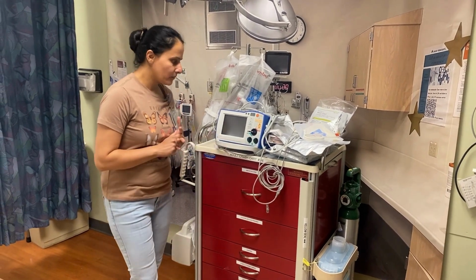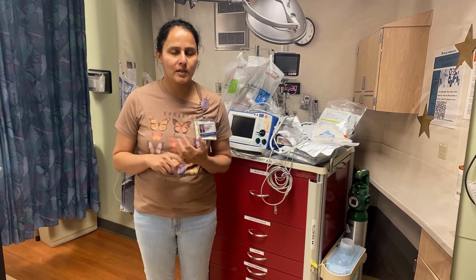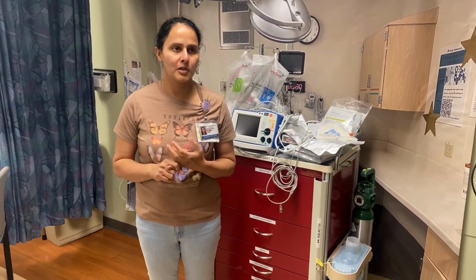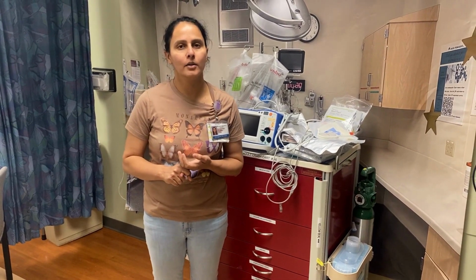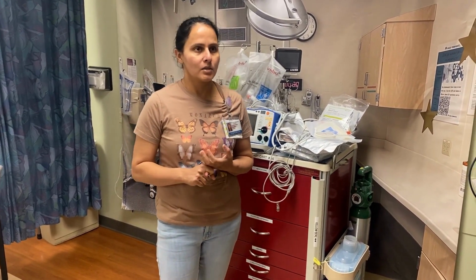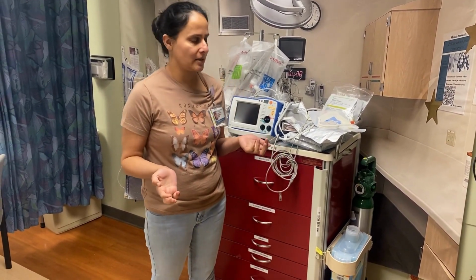This is Sumit, and today we're going to learn about pacing, how to use Zoll for pacing. Let's first talk about people who need pacing. Patients with symptomatic bradycardia, or patients who are not responding to atropine in a third-degree block, require pacing. We do two kinds of pacing, transcutaneous and transvenous. Today we're going to talk about transcutaneous pacing.